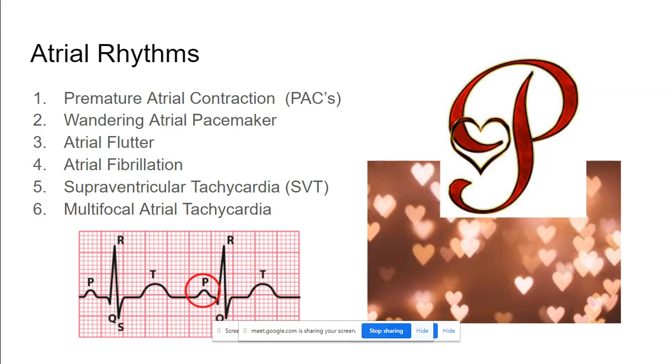So that's all of the sinus rhythms. If every QRS complex has a P wave and our PRI and our QRS measurements aren't too long or taking too much time, then you've got a sinus rhythm. Okay, where the problems begin is when one part of the heart stops doing its job.